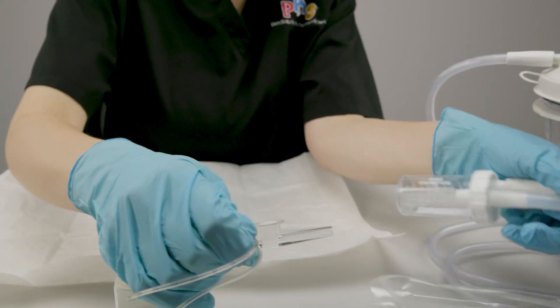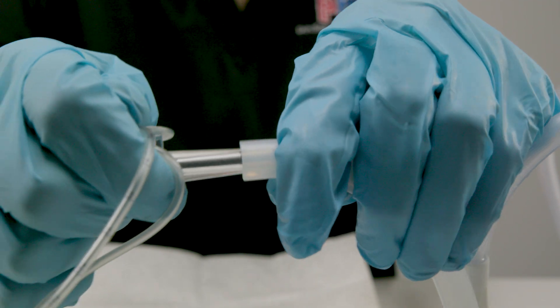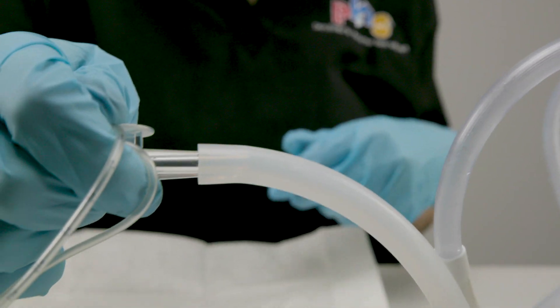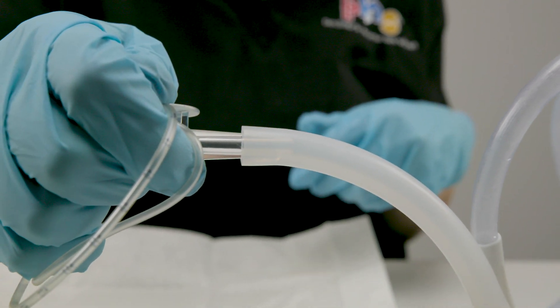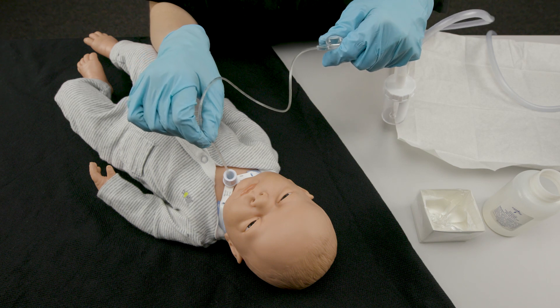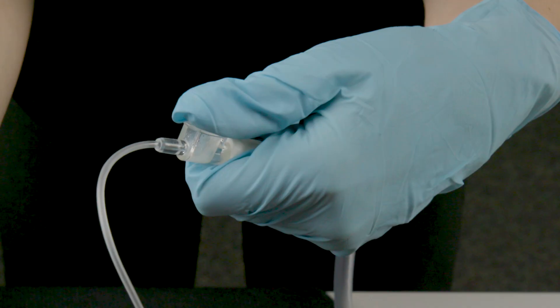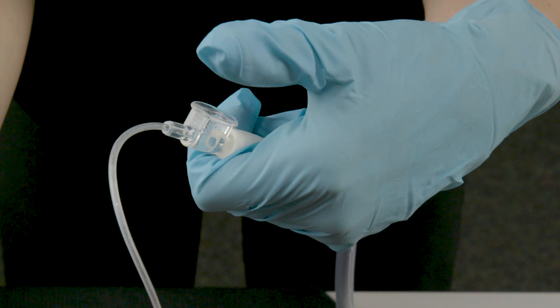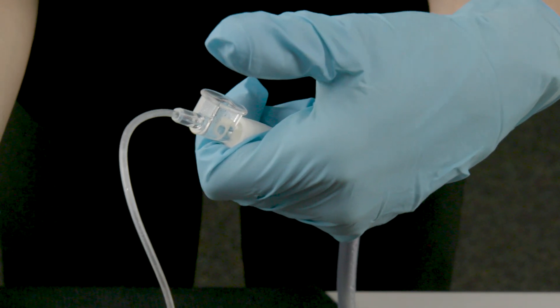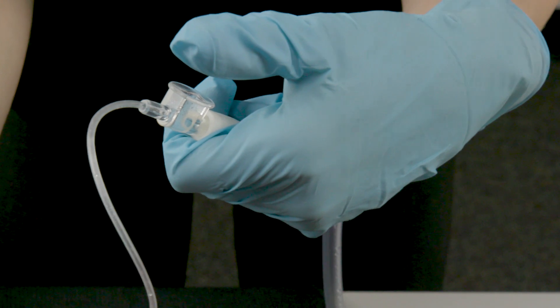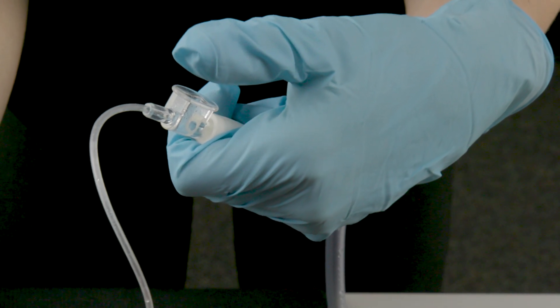Push the sterile suction catheter into the open tubing of the specimen trap. Suction the patient using sterile technique. If necessary, occasionally lift your thumb off the thumb port of the suction catheter. This short release of suction pressure helps move secretions up the catheter.